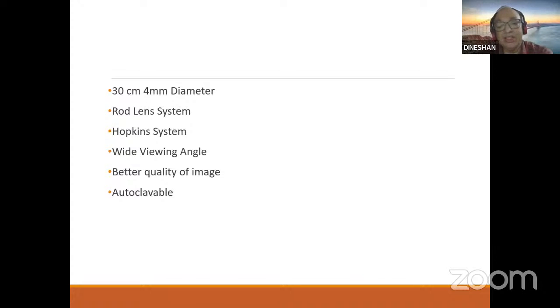Usually the 0-degree was used to see the urethra up to the bladder neck, and then to scan the lateral walls, you used the 70 degrees, and the base you usually scanned with the 30-degree.